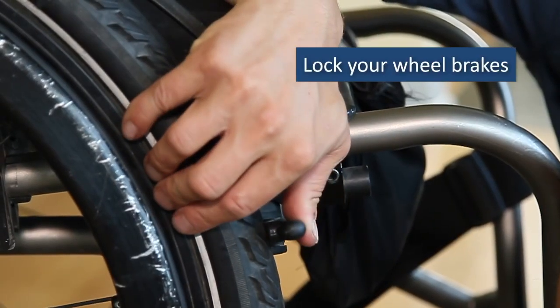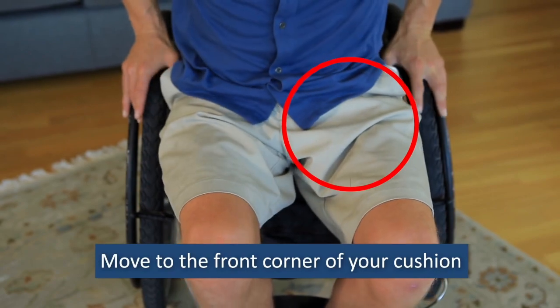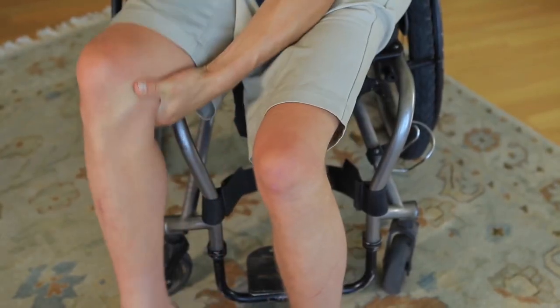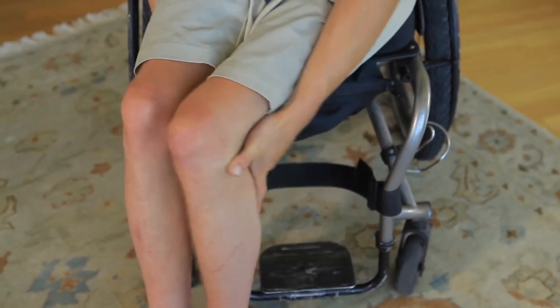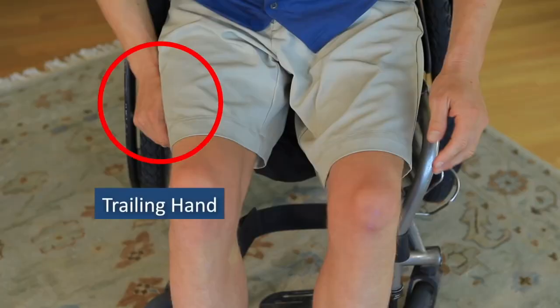Lock your wheel brakes and scoot to a front corner of your seat. You'll be getting out of your wheelchair at an angle, so set your feet on the floor off towards the side. Grasp the front of your frame with your trailing hand.